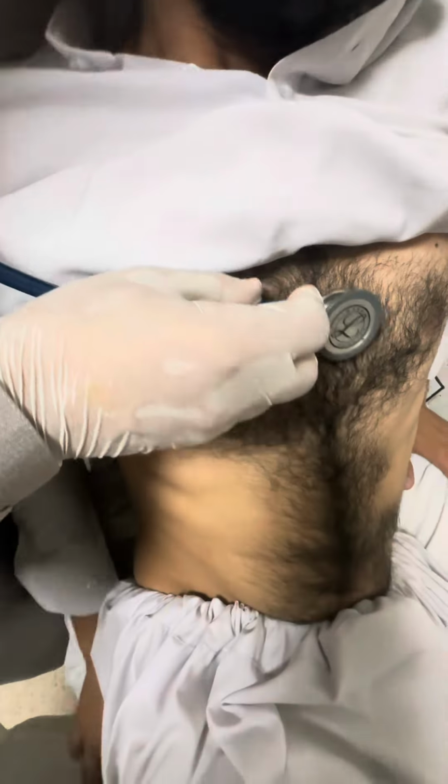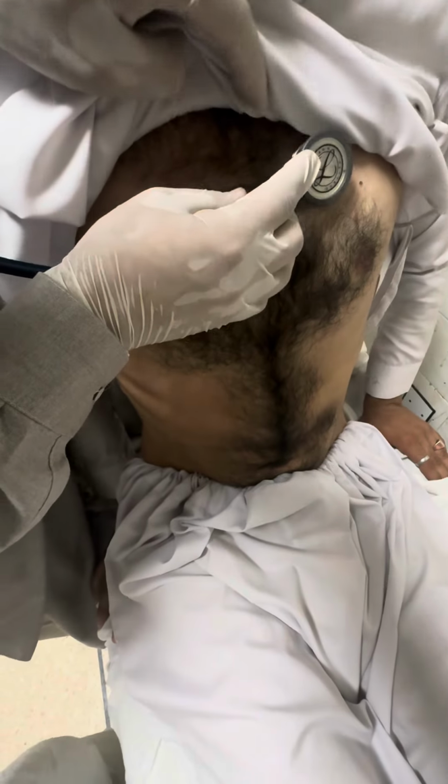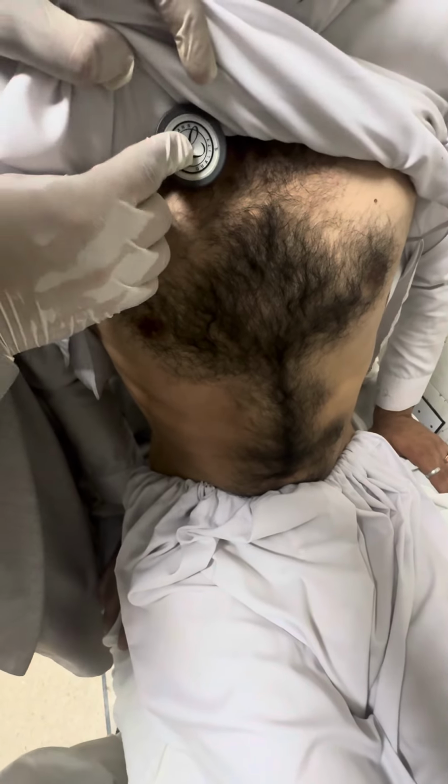If the patient has an aortic murmur, we ask the patient to sit and lean forward while auscultating the aortic stenosis murmur and its radiation to the carotid artery.